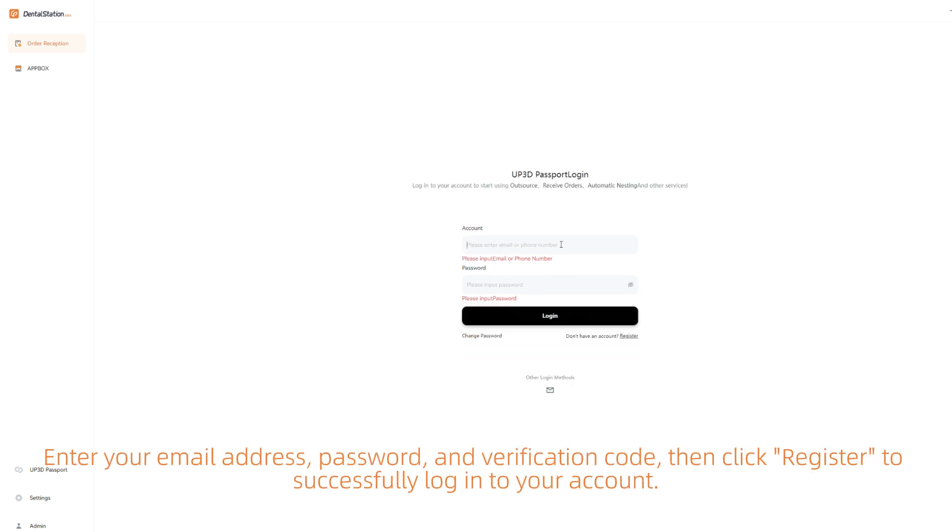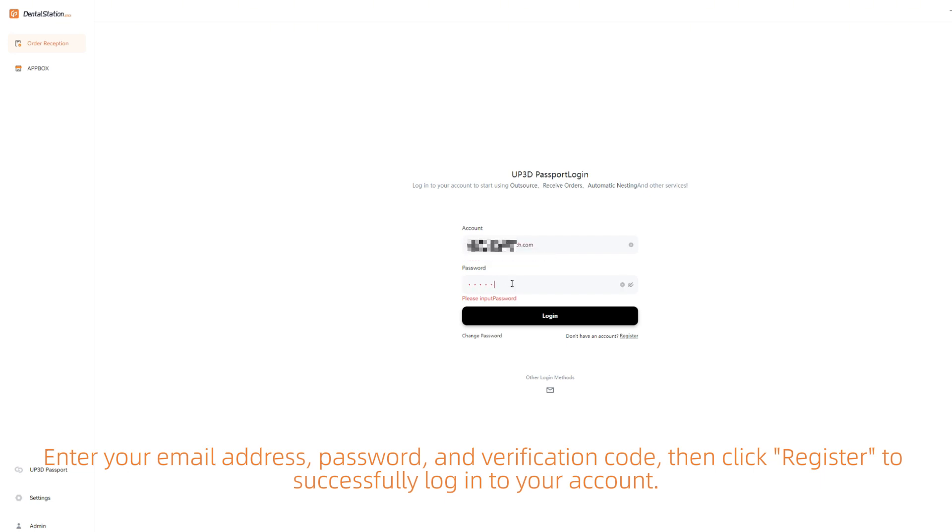Enter your email address, password, and verification code. Then click Register to successfully log into your account.